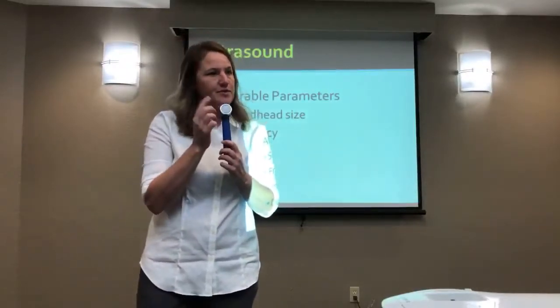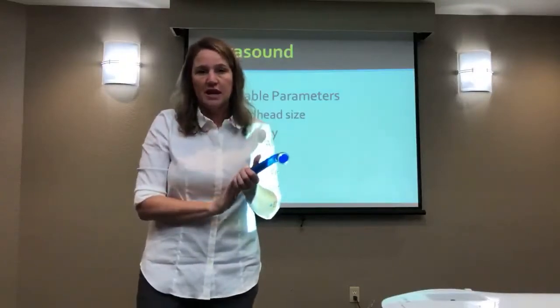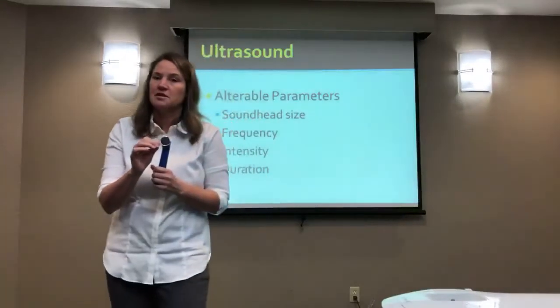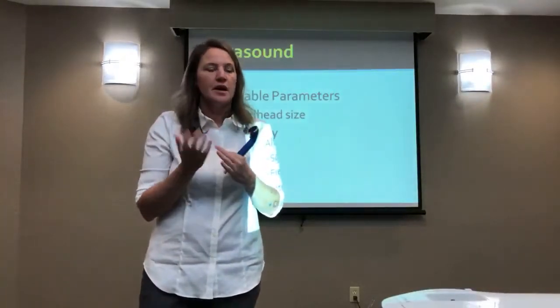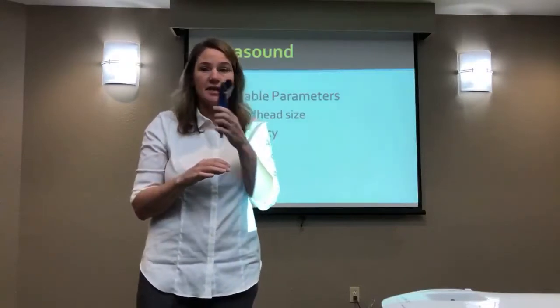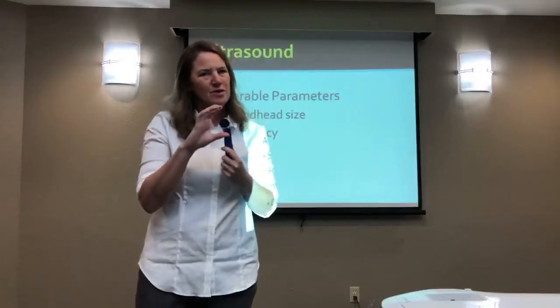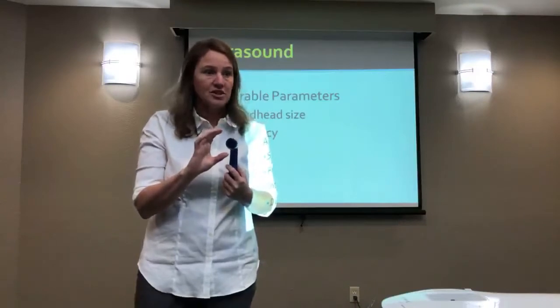So it's just under a centimeter, and it might be appropriate for you if you treat hands, if you need to treat very specific small targets, because if your head is too big, it's going to be difficult to couple, or they come bigger. I have a 10 centimeter head back there if anybody wanted to try it for a larger target. But even with the biggest head, you're still not going to cover a really large area.